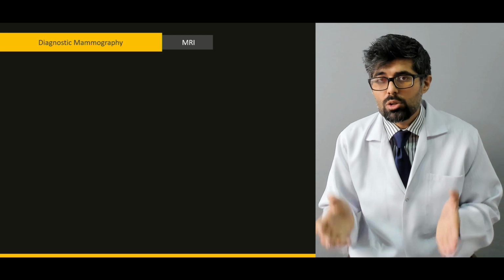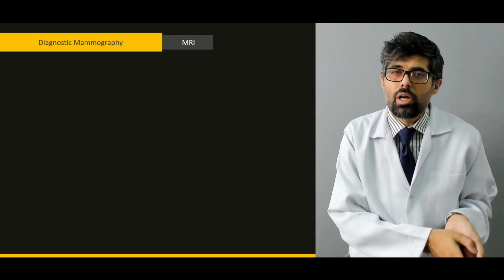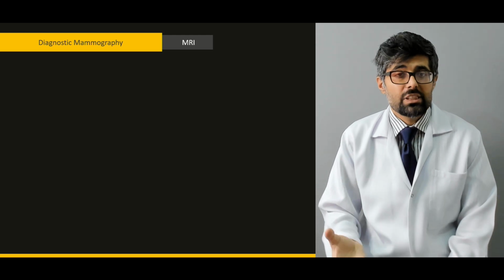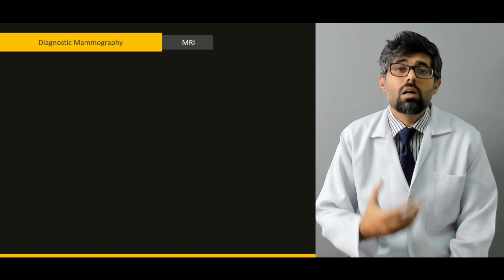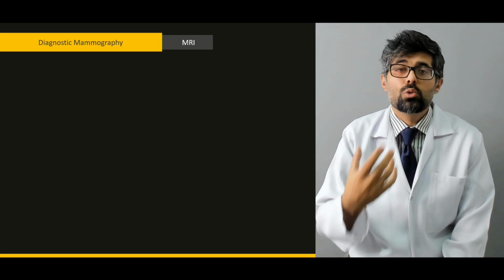So for diagnostic purposes, we not only perform the screening mammogram, we also perform the diagnostic one. We can perform MRI, we can perform CT scan. Both of them can be contrast enhanced, or can be without the contrast. Even a PET exam can also be performed in order to diagnose.